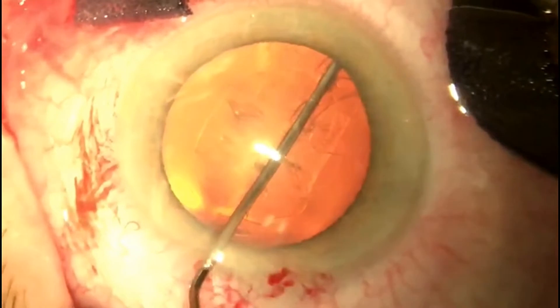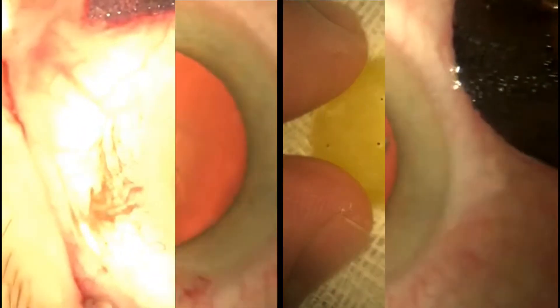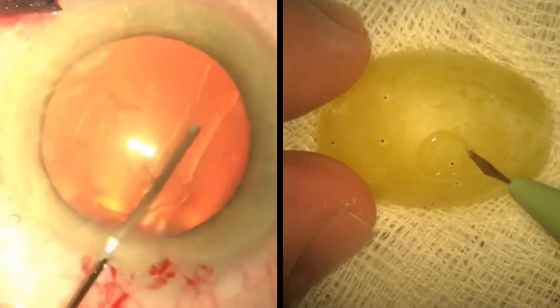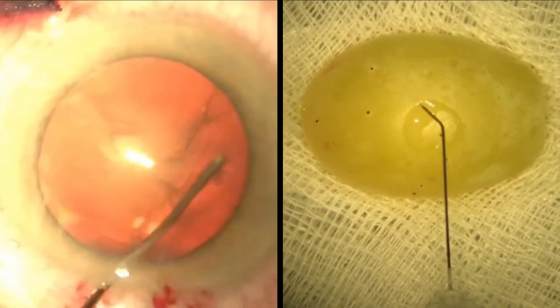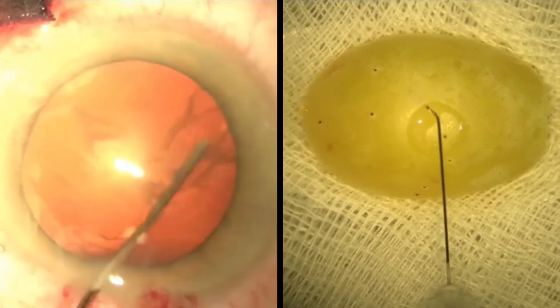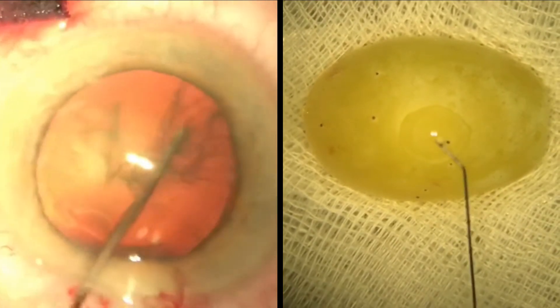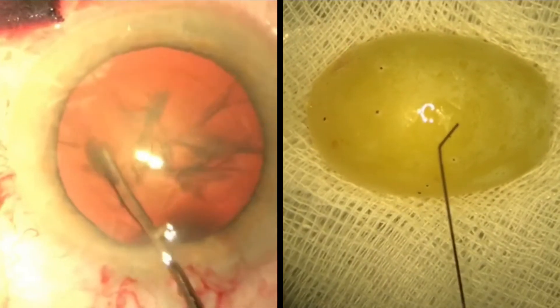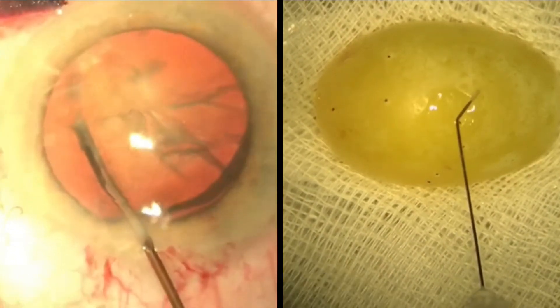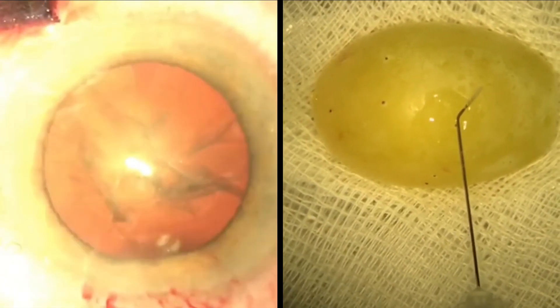Hydrodissection follows on from capsulorexis. Here we have used a grape once again and made a circular slit on its surface. We passed the hydrodissection cannula under the skin of the grape and injected with BSS. We repeated this by injecting at various angles whilst passing the cannula from an appropriate distance and maintaining accurate placement of the cannula.